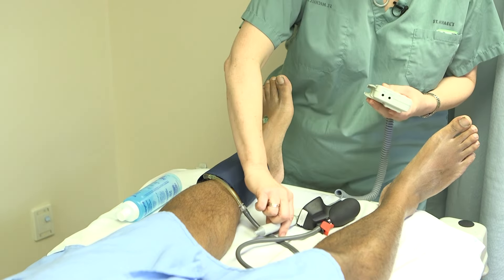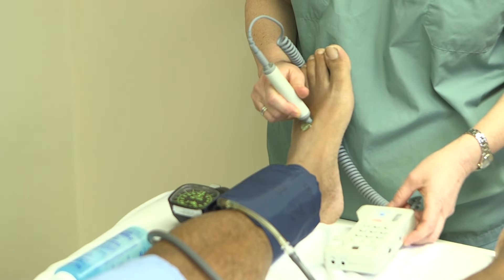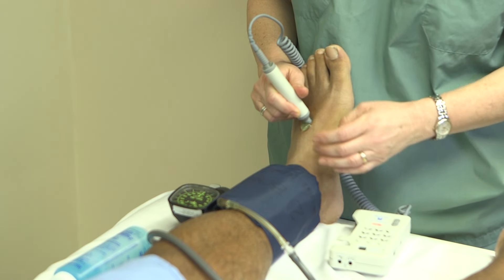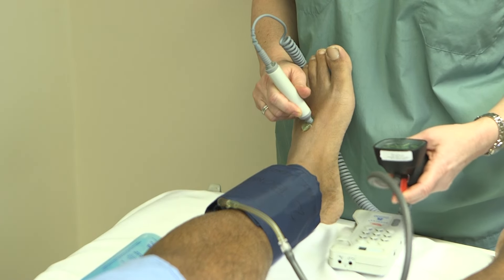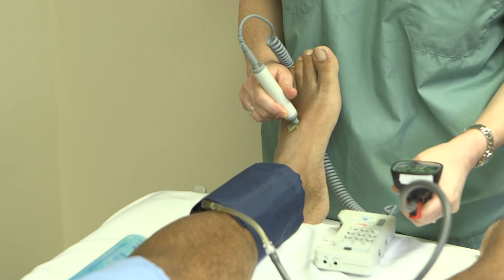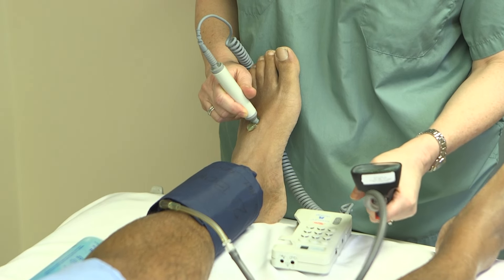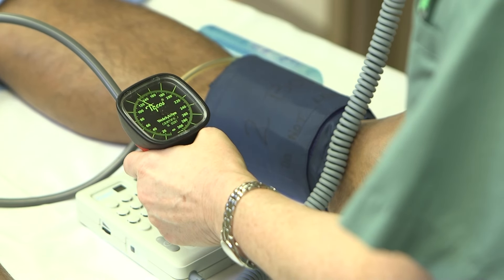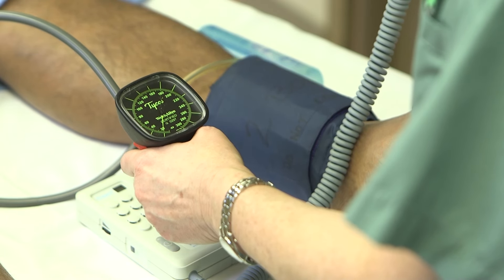Then we're going to use our handheld Doppler to locate the dorsalis pedis signal. Got a nice, strong signal here. Now we're going to inflate the blood pressure cuff until we no longer hear a signal, then gradually decrease the pressure until we hear a return signal. We can see it returned at 100.